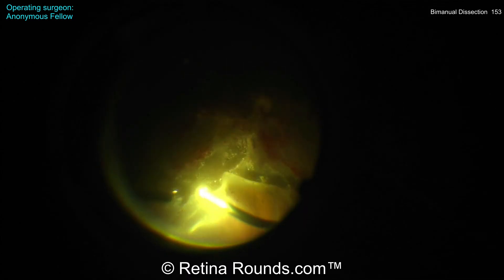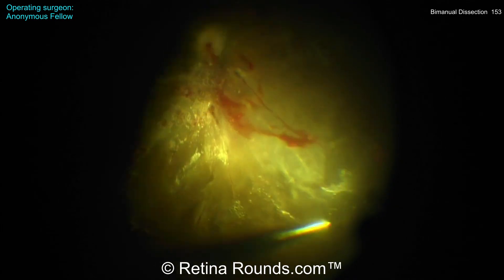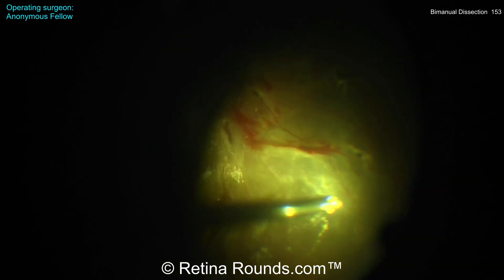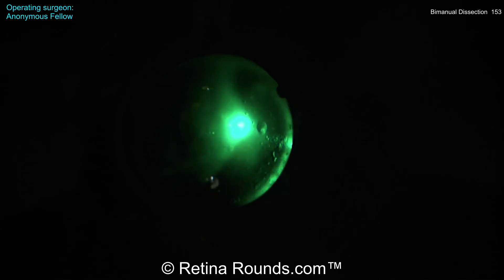Switching to a shave mode here would be a good idea, or even using perfluorocarbon liquid to stabilize the posterior pole while the shave is being performed. Just elevating up the hyaloid to the level of the vitreous base to facilitate as thorough removal of vitreous and shaving as possible. Now there are a number of breaks that occurred during this fibrovascular membrane dissection.